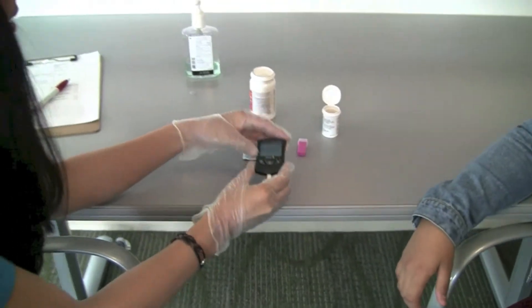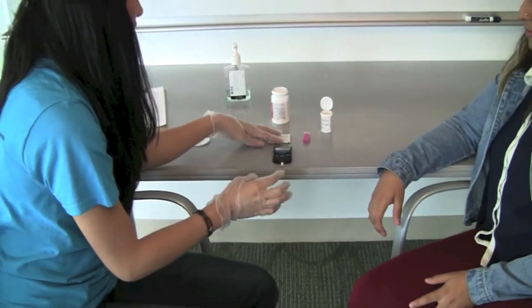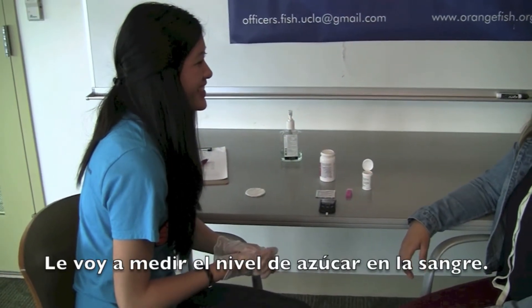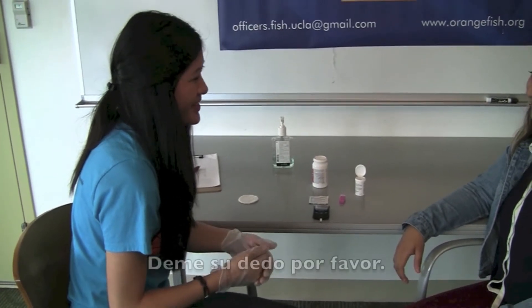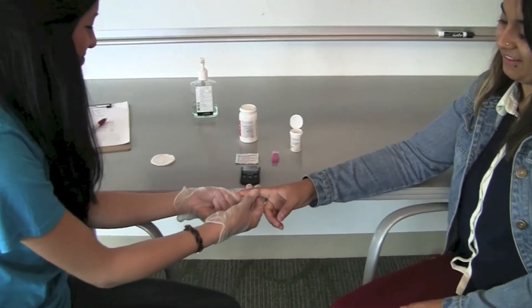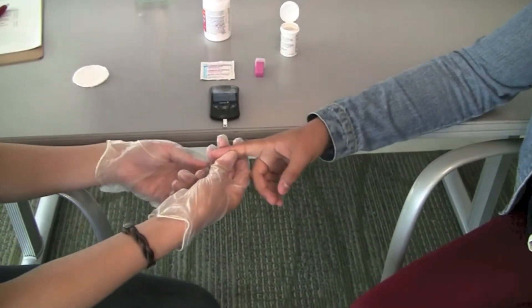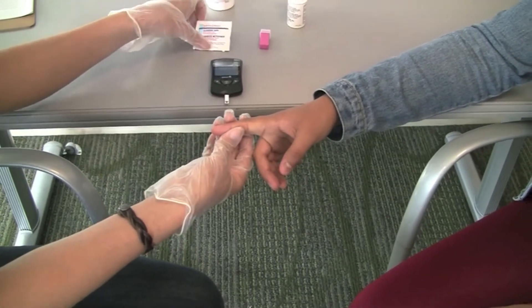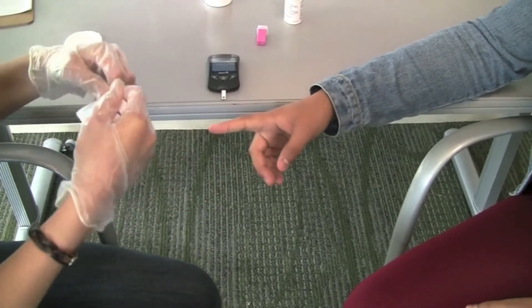Let the patient know you will be taking their blood glucose and ask them for their finger. In Spanish say: [Spanish phrase]. Locate the index finger or middle finger of the patient where the lancet will be used.